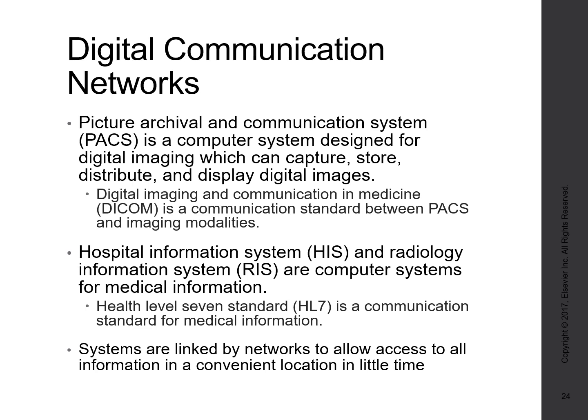So some of the things that DICOM regulates are dynamic ranges of images. So each PACS system would have to meet all the DICOM requirements. So DICOM would be the rules, PACS is the actual system. And so DICOM tells PACS what kind of dynamic range it needs, what kind of resolution it would have to be capable of. So they work very closely together, but DICOM's the rules, PACS is the system.